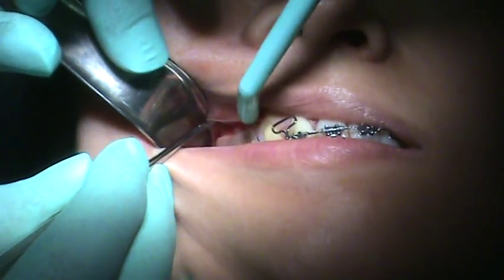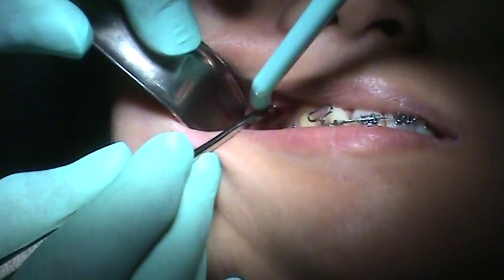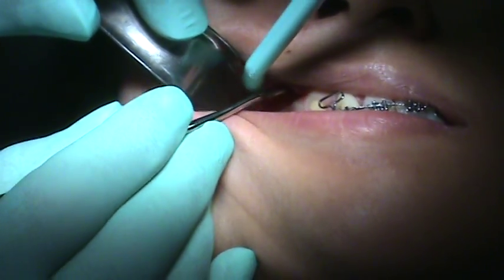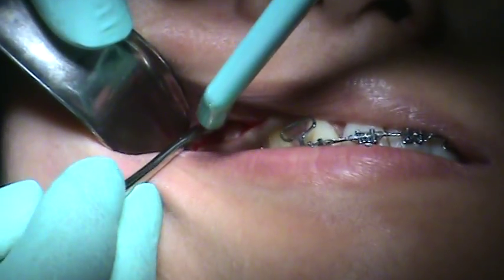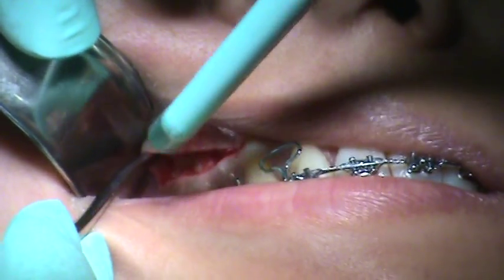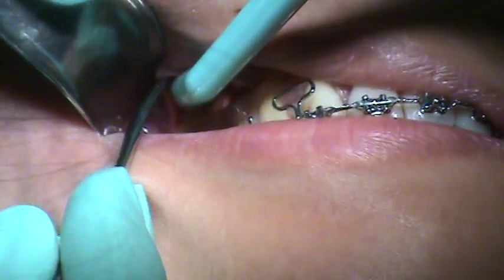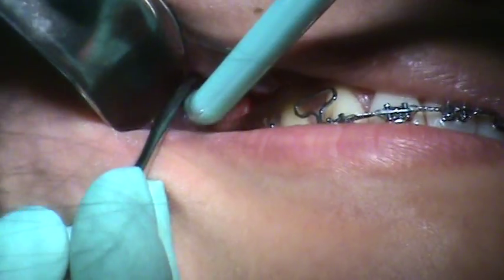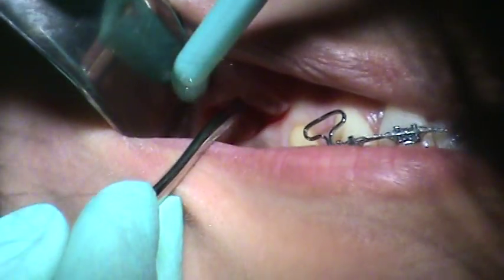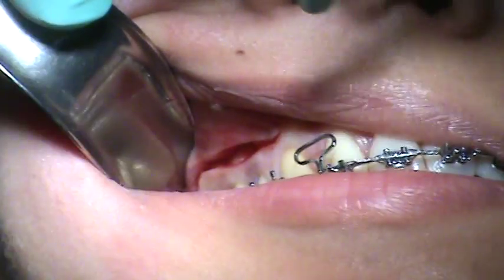Starting with a horizontal incision — it's just at the mucogingival junction. The theory that has also been discussed is to go right into the attached gingiva to reduce scarring. The pros are a decreased chance of gingival scarring. The cons are a little more difficult time closing up the incision site.